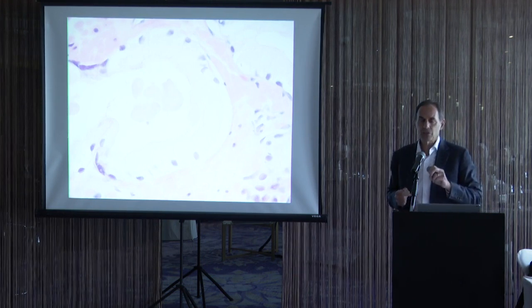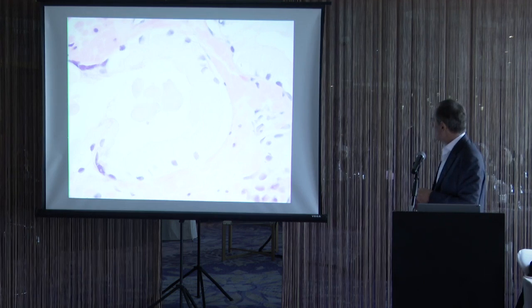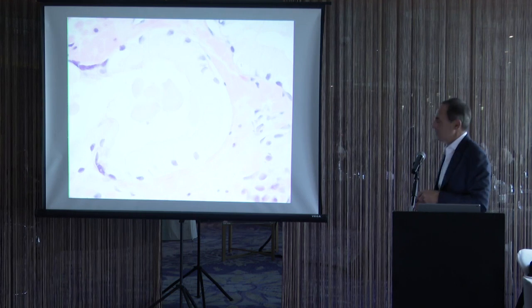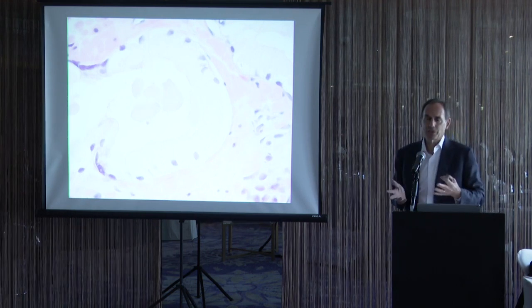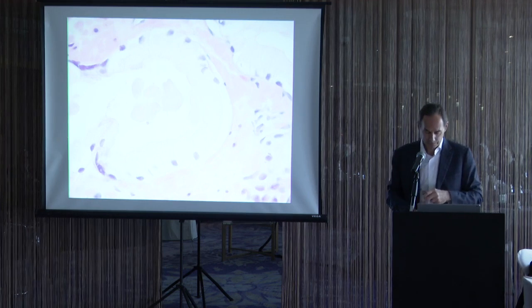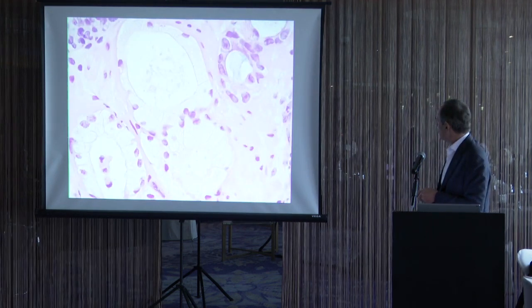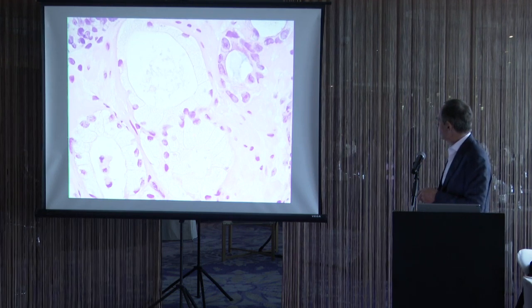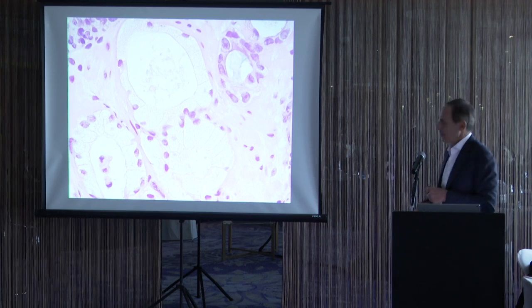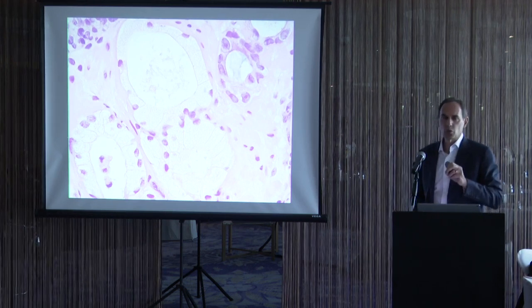But the key feature is the foamy cytoplasm. It's this voluminous amount of cytoplasm where you have 4 to 5 times the amount of cytoplasm relative to the nucleus, in contrast to benign prostate glands where maybe the nucleus occupies 1/2 of the cell height. Sometimes you can appreciate in foamy gland prostate cancer, it almost has a xanthomatous or microvesicular appearance, again with this huge amount of cytoplasm.